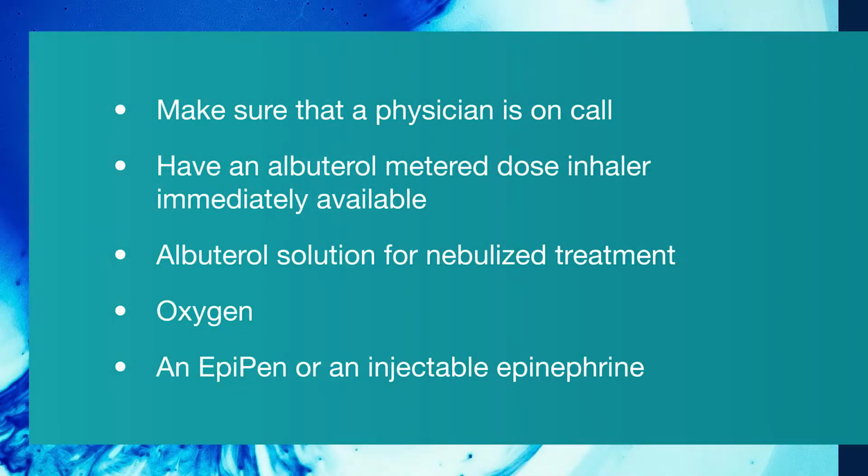Make sure that a physician is on call in the event of an excessive bronchoconstriction or other adverse reaction, and have an albuterol metered dose inhaler immediately available, along with emergency supplies such as albuterol solution for nebulized treatment, an EpiPen, or an injectable epinephrine. These may vary by institution and protocol, and you should consult your institutional guidelines.